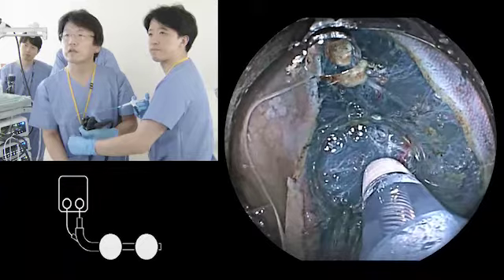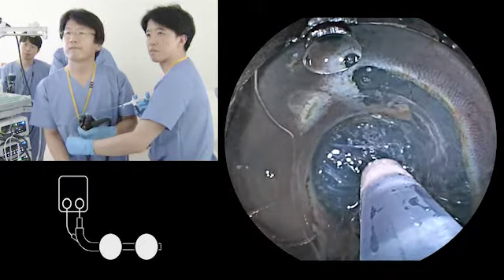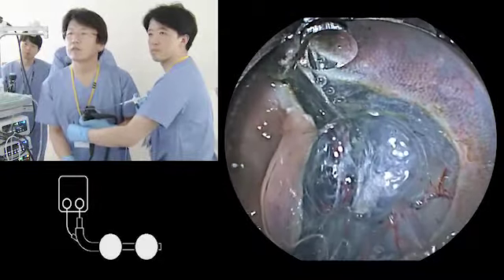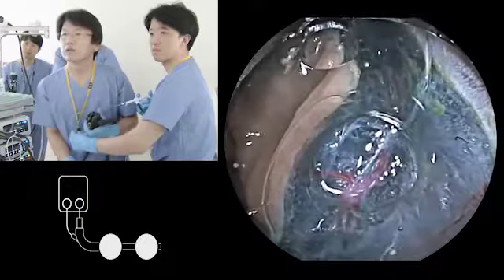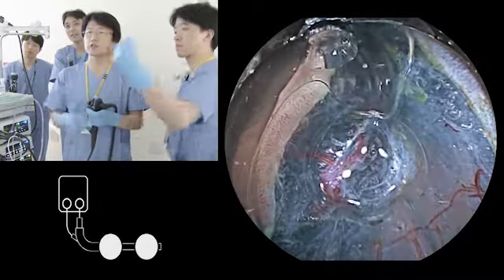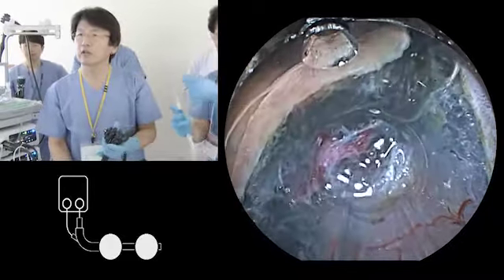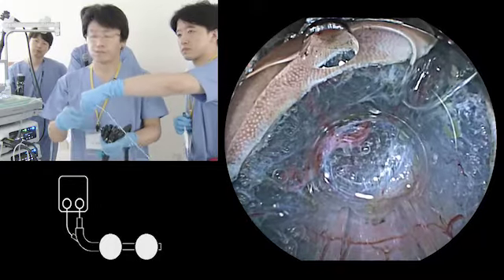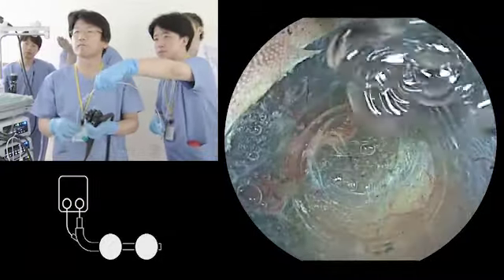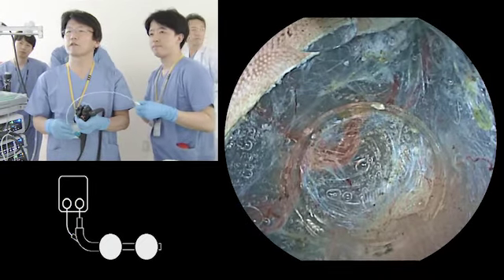Okay, here. Can you inject your solution from the knife itself? Yes, yes, I can. But now I want to inject mucoup here. Oh, okay. Because I want to make the submucosal tissue right above the muscle layer thicker. So the vessel comes to the mucosal side, and you inject the solution just below the vessel? Yes. Below the vessel.